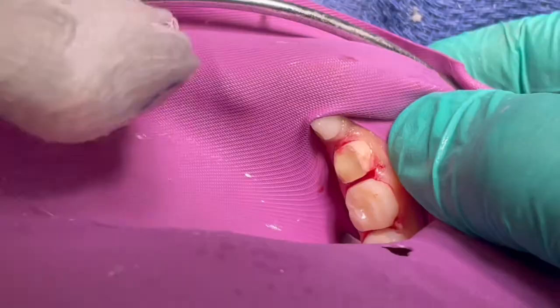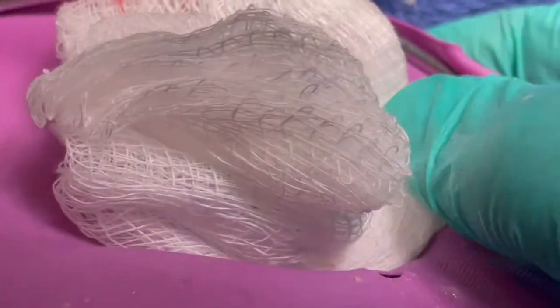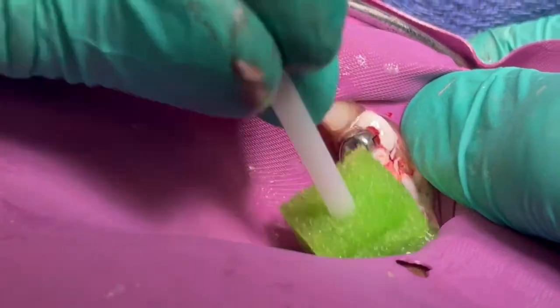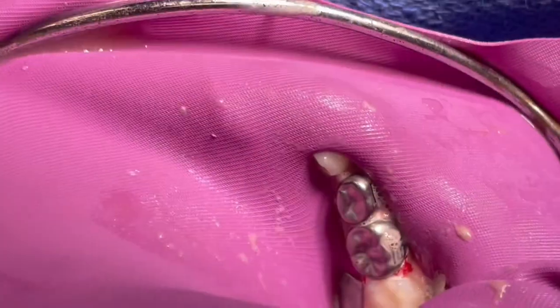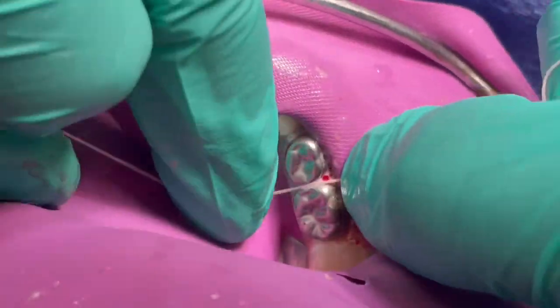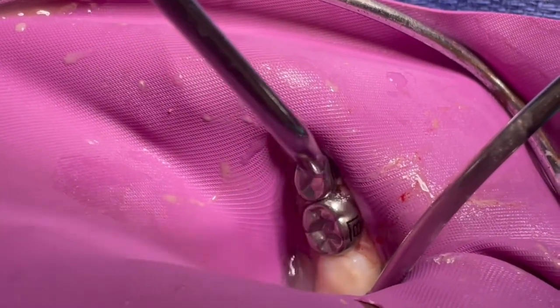Here I'm trying my crowns on, making sure I have good retention, then I'll take a Raytec and dry the area and make sure it's nice and clean. In this video we're cementing these crowns with a glass ionomer cement like Ketac Cem. I still like to use a pure glass ionomer cement like Fuji 1 or Ketac Cem for stainless steel crowns, or an RMGI like Fuji Cem 2. I'll use a scrub brush to clean excess cement rather than aggressively rinsing right away, due to the poor dimensional stability of glass ionomer cement when initially mixed — it's highly susceptible to water solubility.